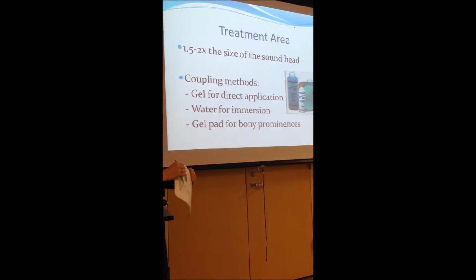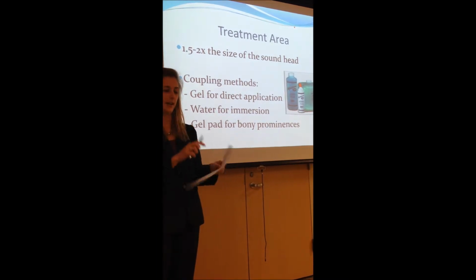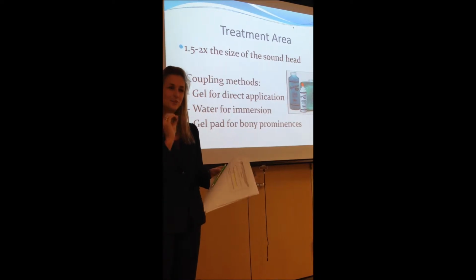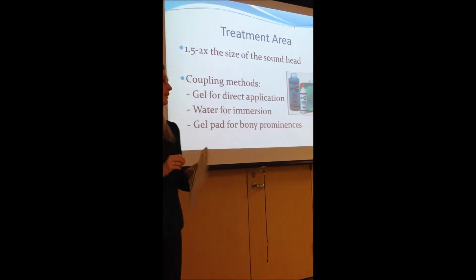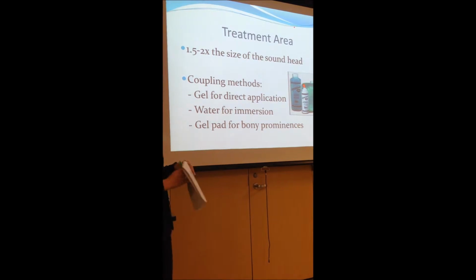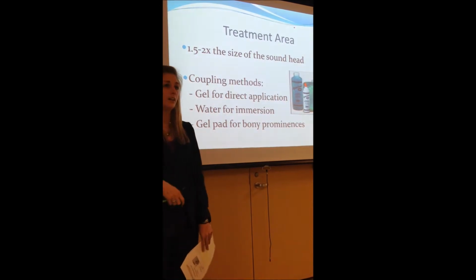Okay, treatment area. 1.5 to 2 times the size of the ultrasound head. So we have our ultrasound head here, and we're only going about 1.5 to 2 times this. We're not going to the car wash here. Small circles, and continuous movement is key. If we stay in one spot too long, your patient might feel a zap and it'll make them uncomfortable, so we do not want to do that. And here are our methods: the gels, water, gel pad, and again, the PT should specify what they want.